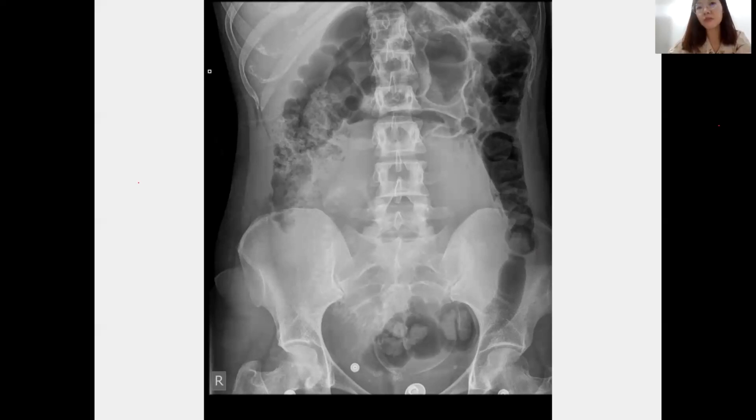Diverticulum. Rarely we will see diverticulum on X-ray, specifically on barium enema, then we can see. Closed loop obstruction. Wow, very interesting. Bowel ischemia. Why do you say bowel ischemia? I will ask this question for you: is bowel ischemia a clinical diagnosis, or can it be diagnosed radiologically?